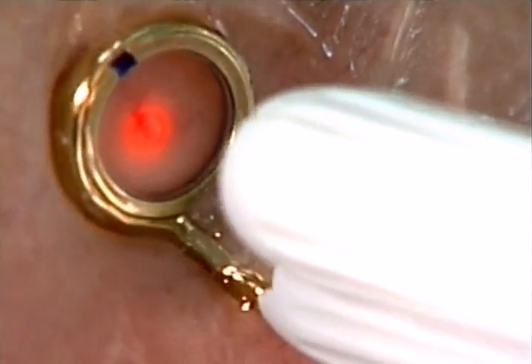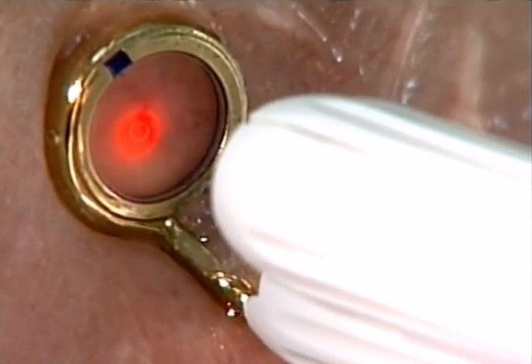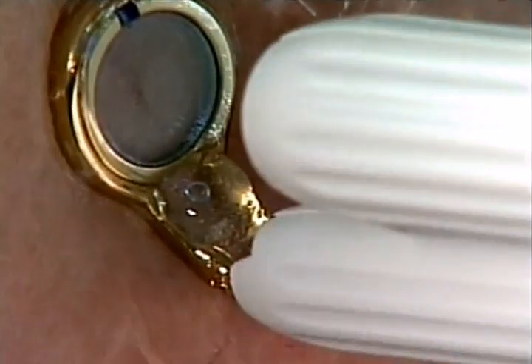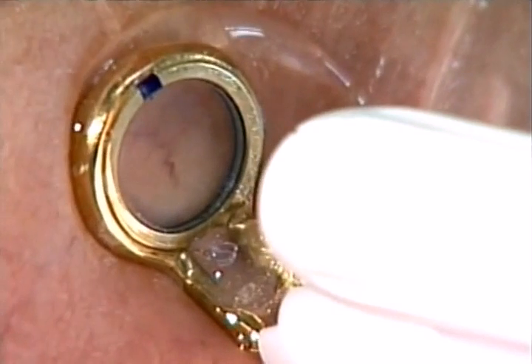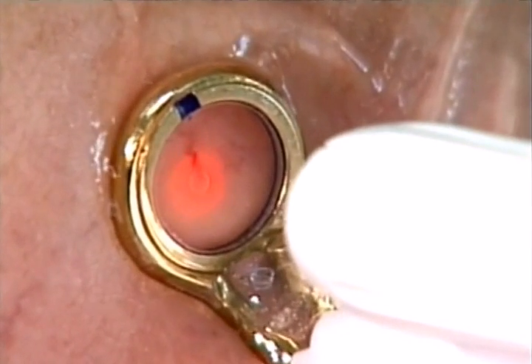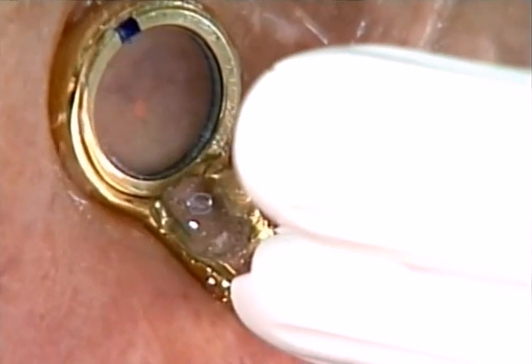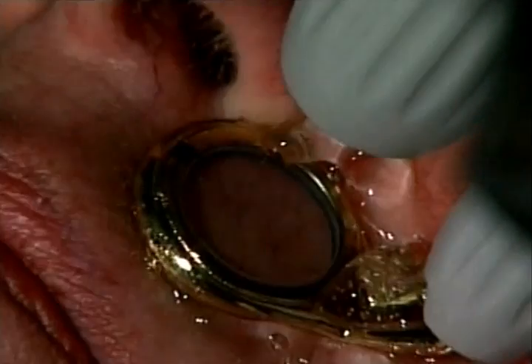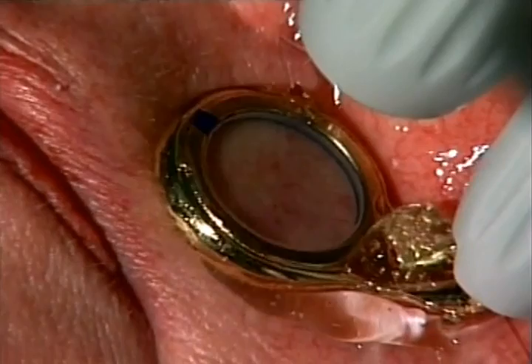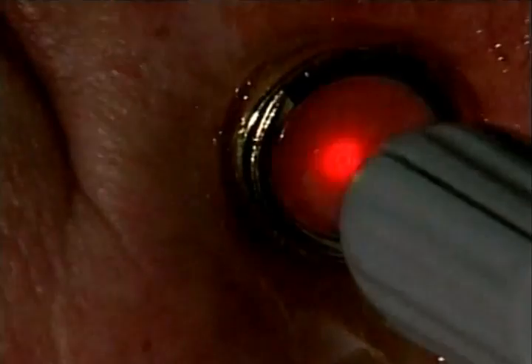So on this one, if you can watch that, I had 2.6 millimeters. Now I'm going to go to 1.7 millimeters. And that compensates for my pulse duration and my fluence based on the size of the vessel. And now it's just testing itself, making sure everything's set. There we go. And with the small spot size, you can be very careful, but you can use this for the vessels on the face also. The small spot does limit the depth of penetration of the light, the 1064 light, so it's a little safer on the face with this.